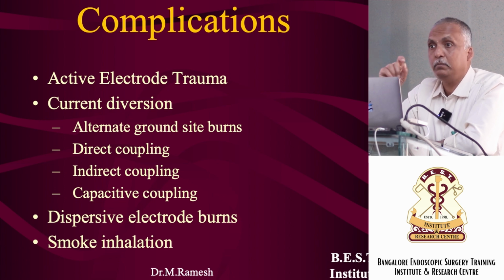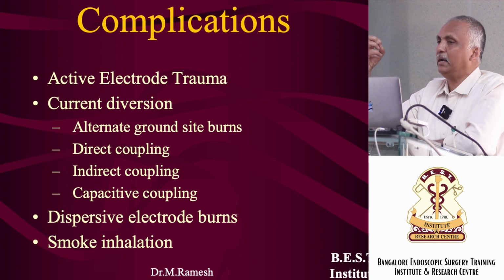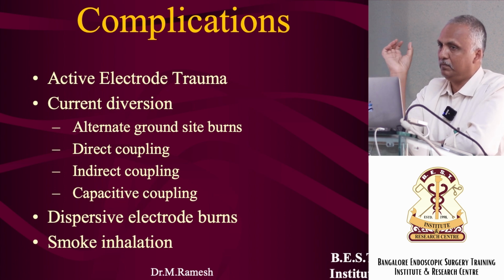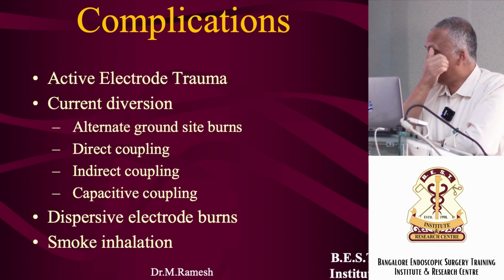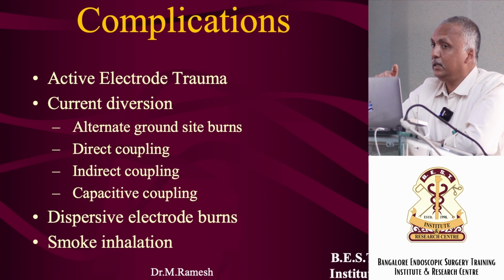Now we have the blue plate, and in the blue plate you have a gel. It's a gelled plate. When a gel is applied, like your ECG electrodes, it is supposed to give maximum conductivity, so the plates have become even smaller. That is the reason the size has been coming down, because conductivity is better, but still there is a caveat.